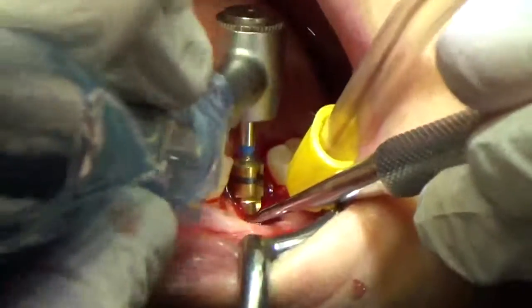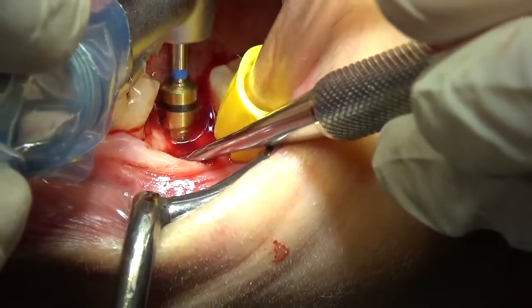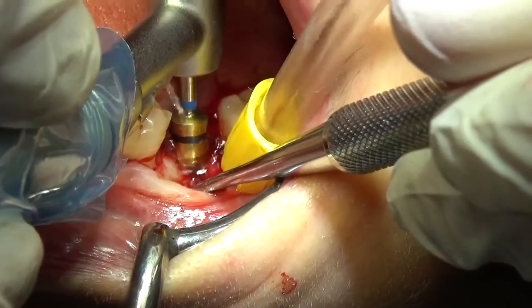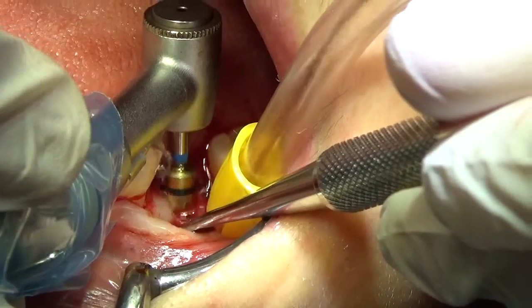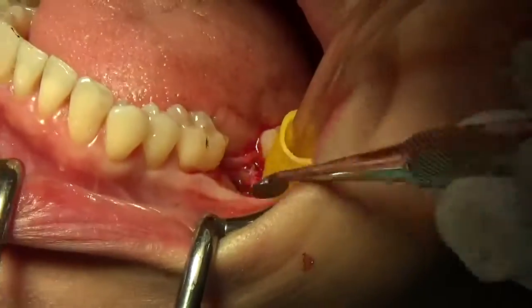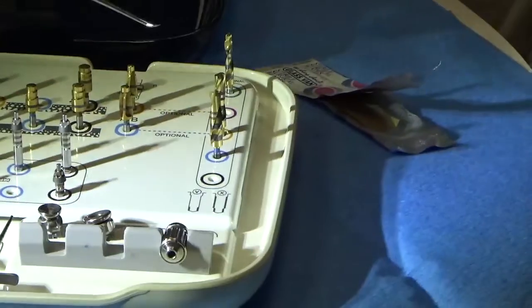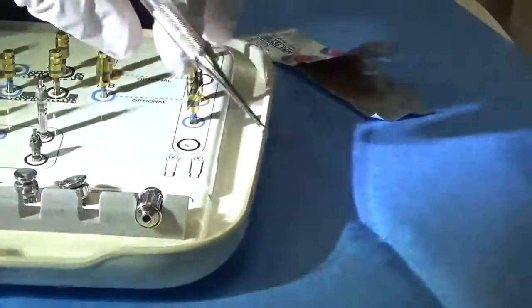So we're just going to line it up. It falls right into our osteotomy, right where we planned it. Giving me quite a bit of resistance, actually. So I'm actually going to take this one step further. And in the Astra kit, the very last line of drills is for the dense bone. So I'm going to go all the way to the dense bone drill.